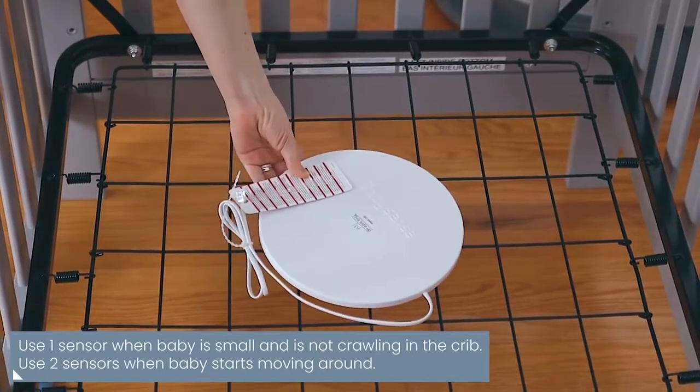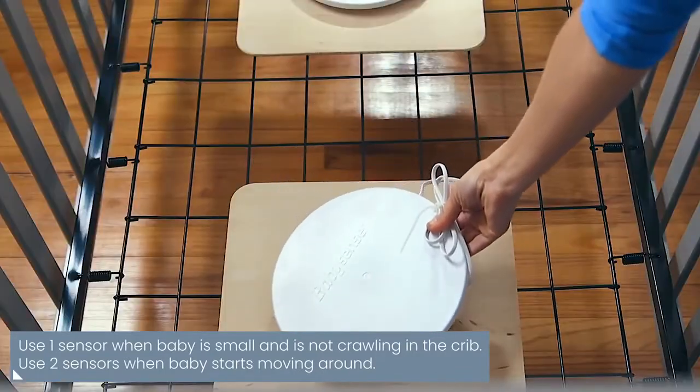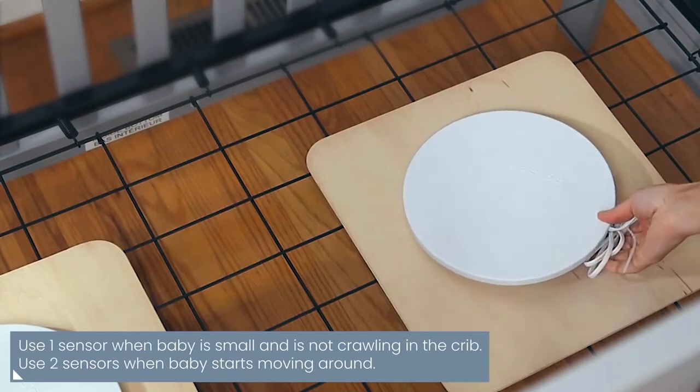For babies who are not yet crawling, use only one sensor. When your baby starts moving around, use two sensors to ensure full bed coverage.